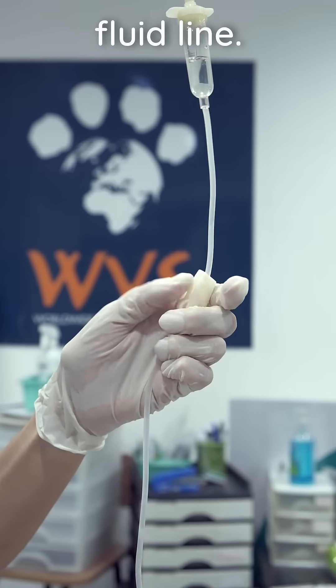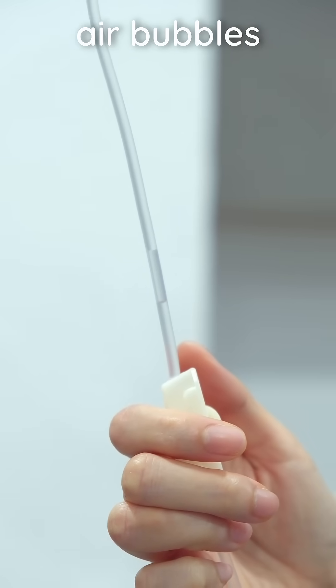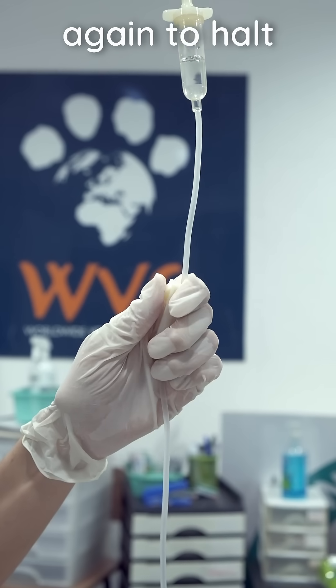Slowly open the roller clamp to fill the fluid line. Ensure no large air bubbles remain within the line. Close the roller clamp again to halt fluid flow.